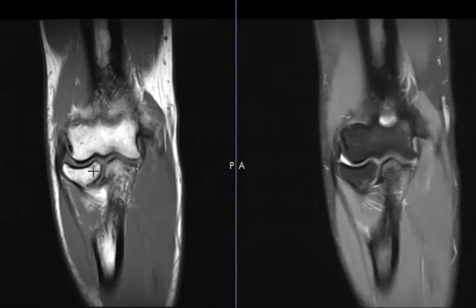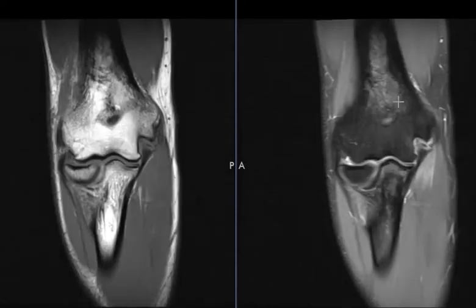We can see over here a T1-weighted image where marrow is bright, and this is a fat-suppressed proton density sequence where marrow is dark and subcutaneous fat is dark here.